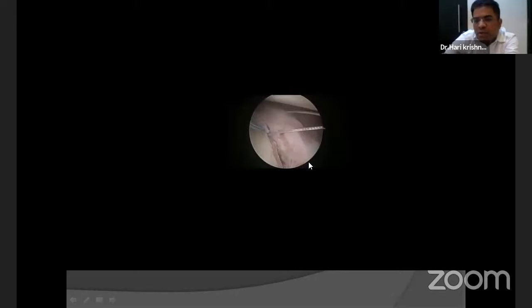So in this video, it demonstrates that I pass my knot pusher up to here to see whether there is a knot here or not. The knot pusher comes and checks whether there is a knot here, and then I start applying the suture knots from outside the portals, from the cannulas.